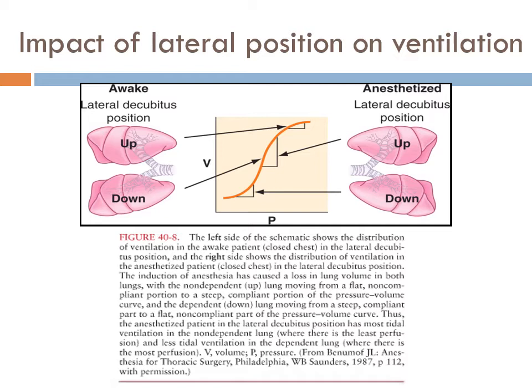So what you can interpret from here is, if I start here, let's just pretend we have imaginary lines of 5, 10, 15, whatever. If I get 5 centimeters of pressure, I barely get any volume, because this is volume, this is pressure. From 5 to 10, I add 5 and get nothing for volume. That would mean it's not very compliant, right? But as soon as I'm at, say, the 15 mark to the 20 mark right here, my volumes are great. I found that threshold to pop those lungs open and actually finally get real volume of air in.